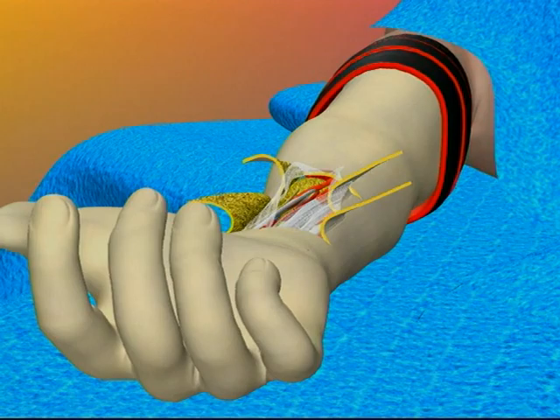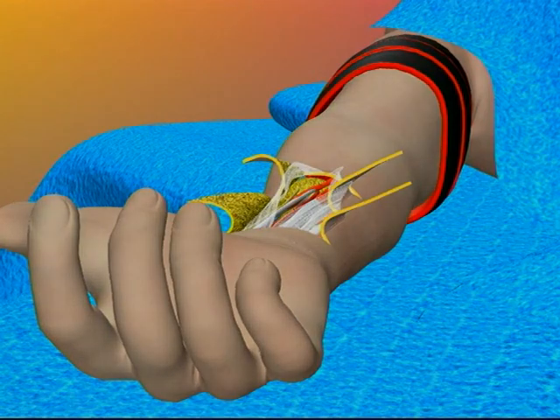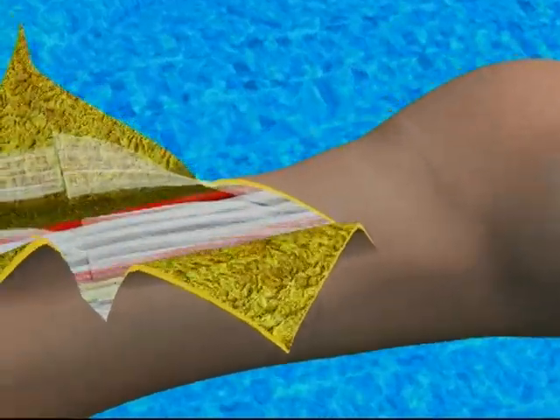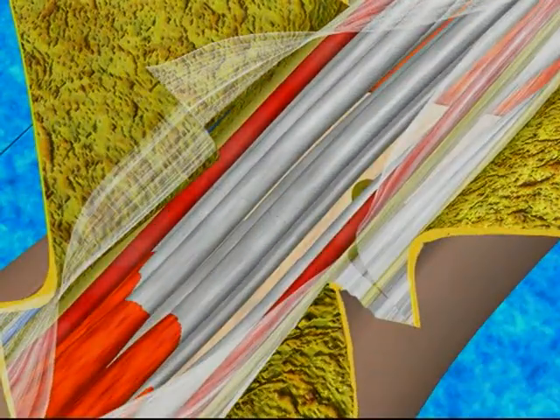Now the tourniquet is released. The surgical team watches for the hand to become pink with the return of circulation, and the pulsation of the arteries is observed.